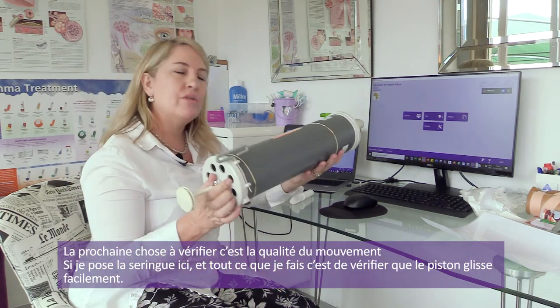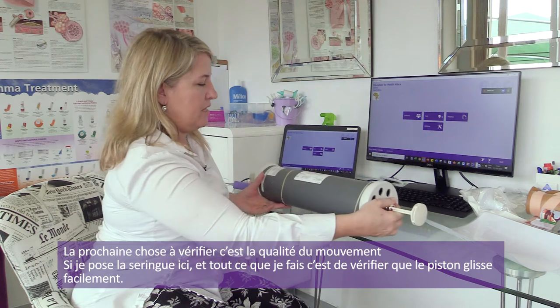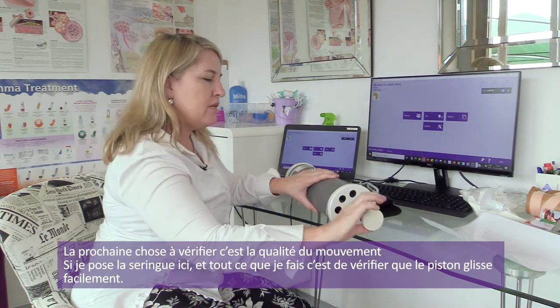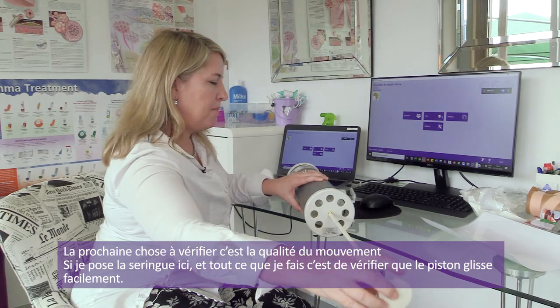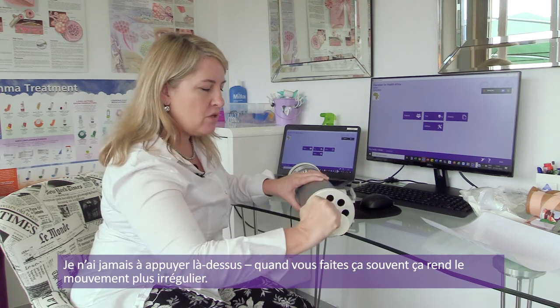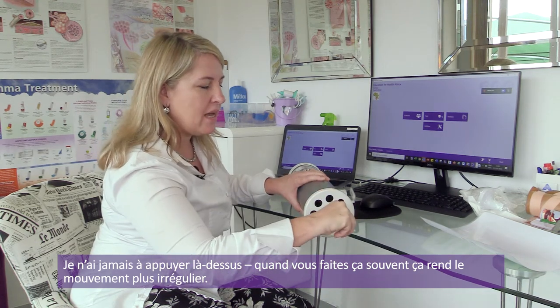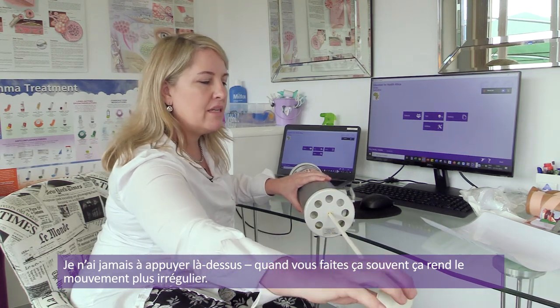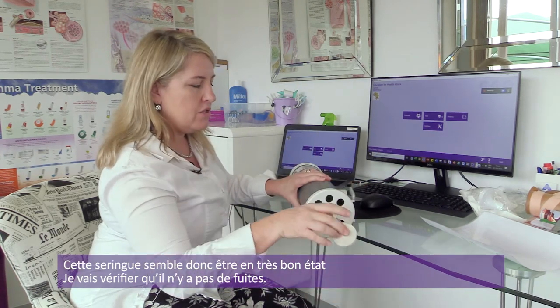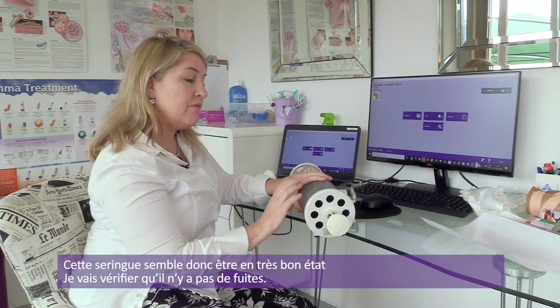The next thing I'm going to do is a smoothness check. What I'm doing is just checking that the plunger is moving nice and smooth. You can see how I never press on the syringe handle with my full weight, because when you do that, it often causes it to jiggle as it goes in. The syringe seems to be in very good working order.